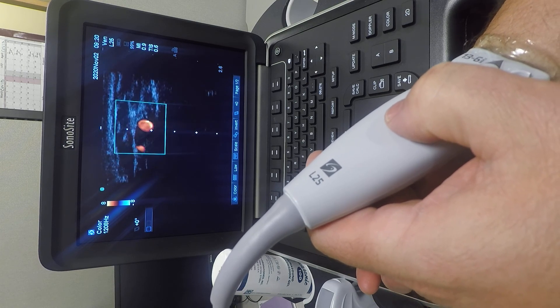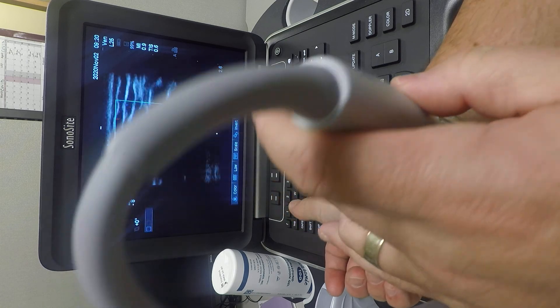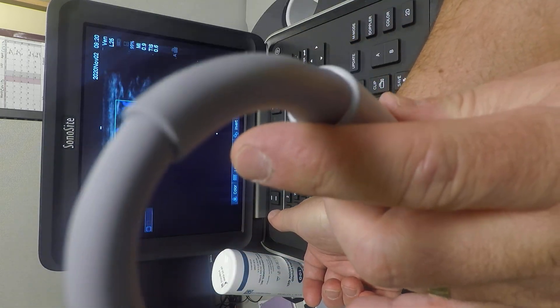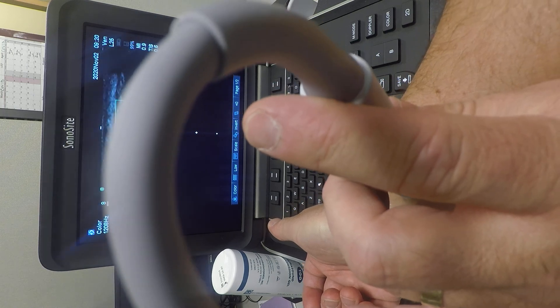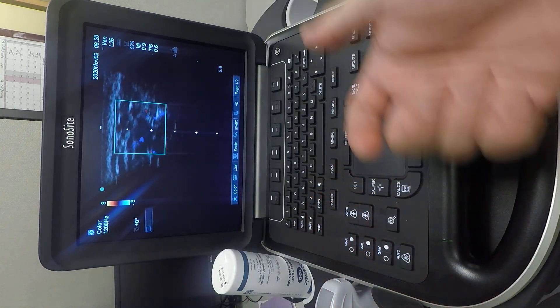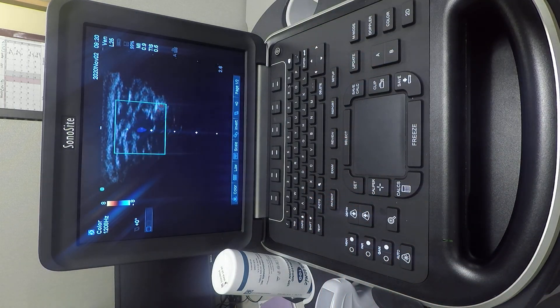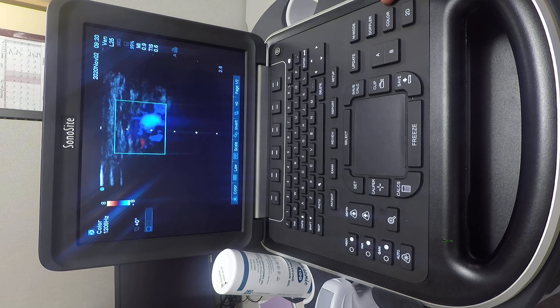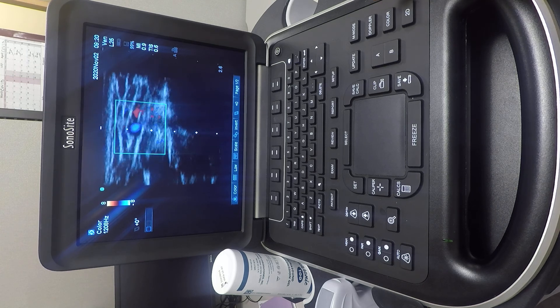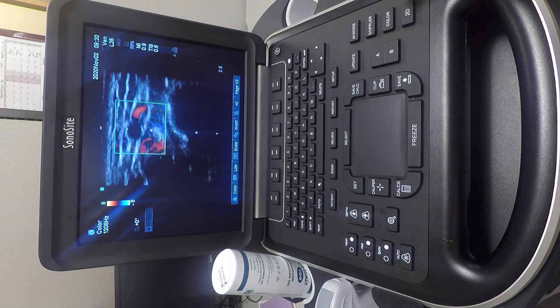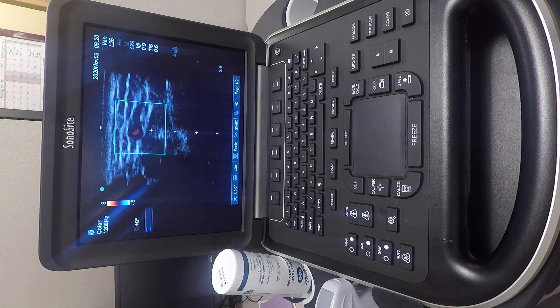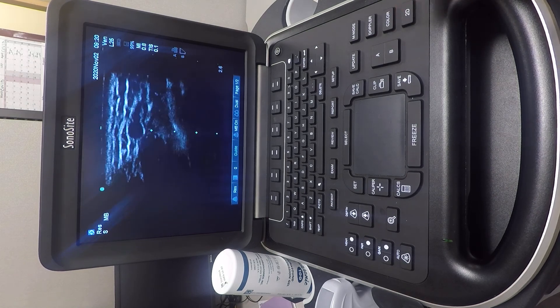If you angle the probe differently, flow will then appear to be going away. That's how you use the color button to identify arteries and veins. To go back to the main view, use the 2D view.